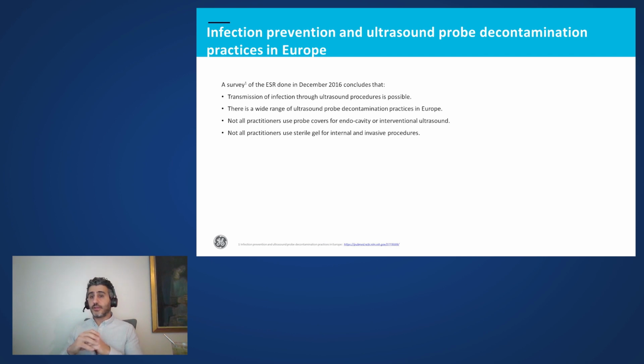We can also find out that ultrasound probes could be a source of germs in a hospital environment, and that there was a wide range of ultrasound probe decontamination practices around Europe.